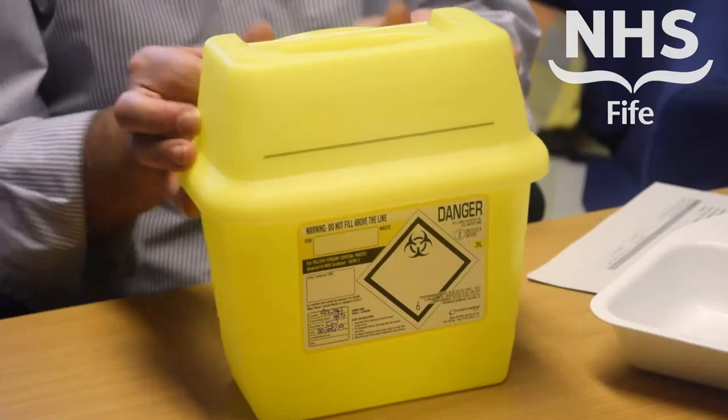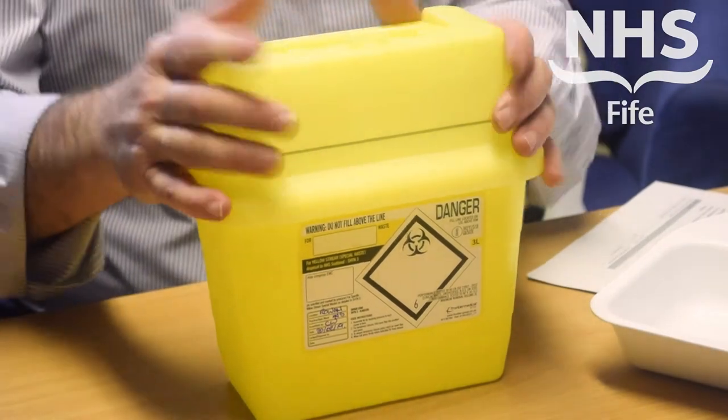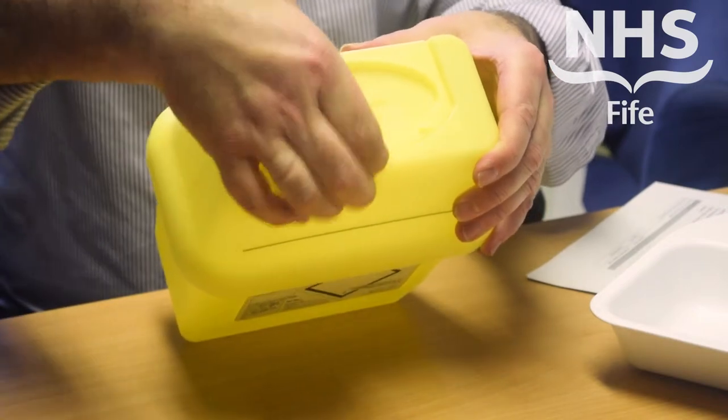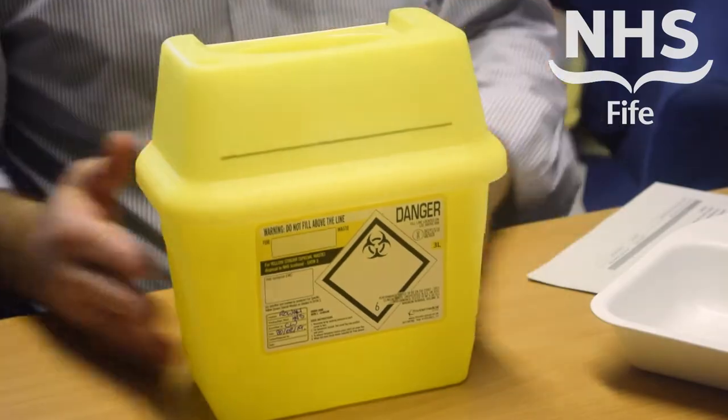It's important to use the temporary closure. When the bin is not in use or if it's being transported, that simply locks in place with a simple click at the front, and then you re-open it when you want to use the bin in practice.